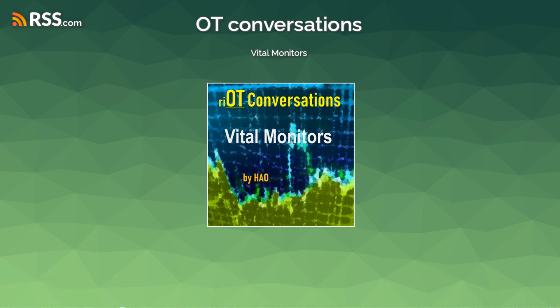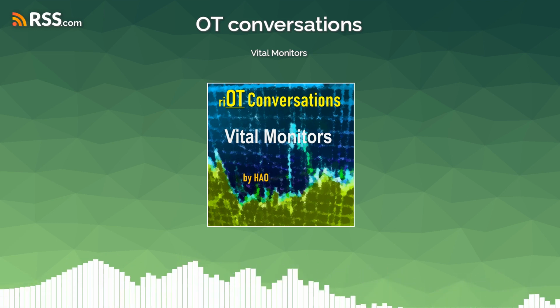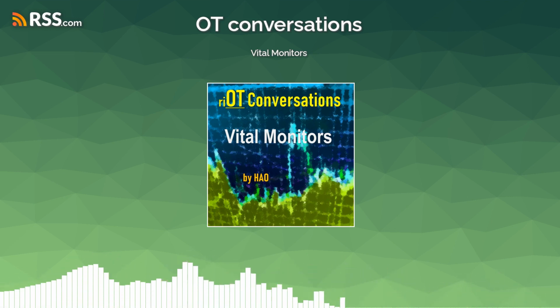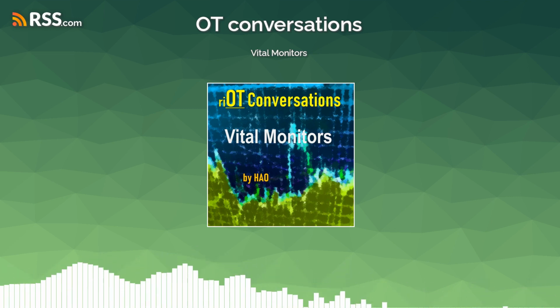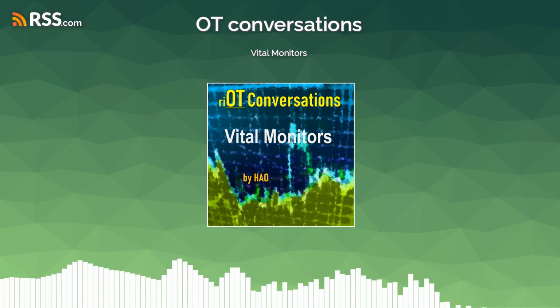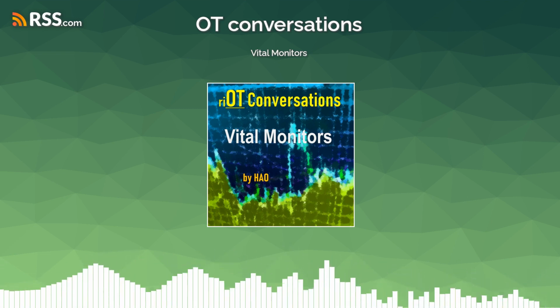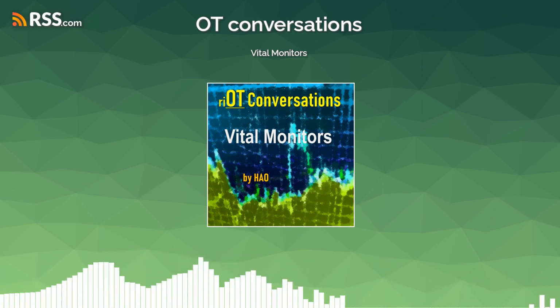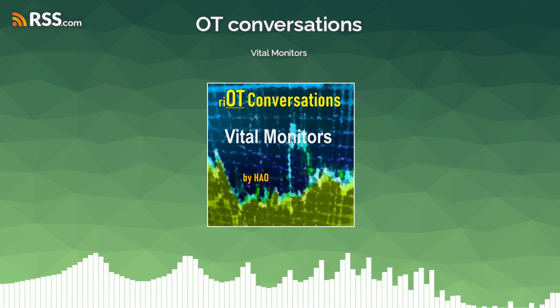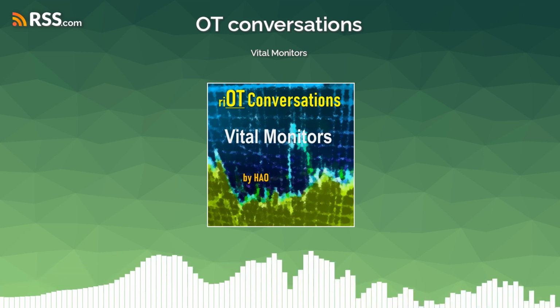So you can see it monitors the cardiovascular system, and it measures subtle changes, including the responses to medication, the responses to stress, and the patient's responses to activities as well. If it is in place, as therapists, you can do some activities, providing that the activities do not interfere with the location of the catheter's insertion.